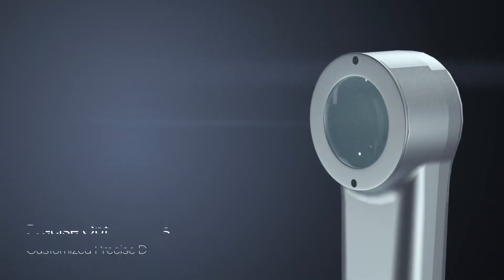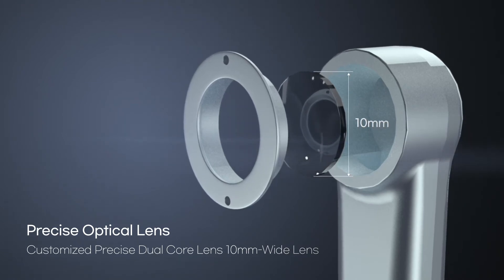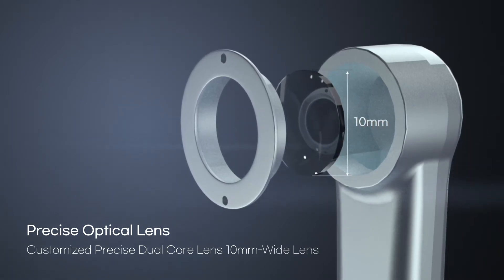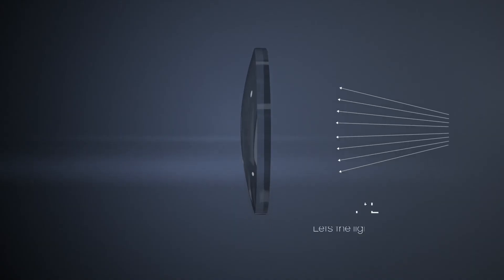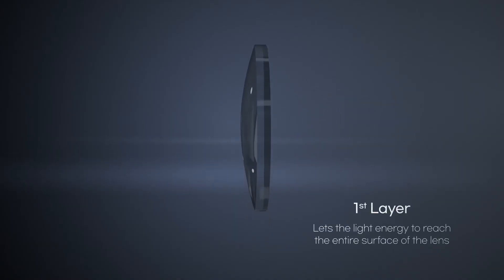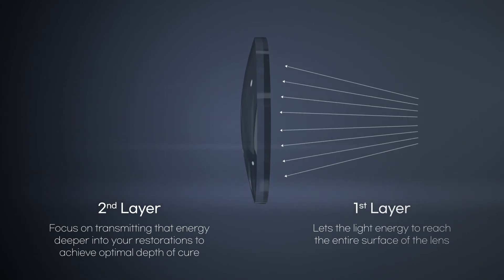Customized precise dual-core lens technology maintains the beam parallel and transmits the light evenly on the surface of a 10mm wide lens to achieve even and perfect polymerization. Then, the second layer of the lens focuses on transmitting that energy deeper into your restorations to achieve optimal depth of cure.